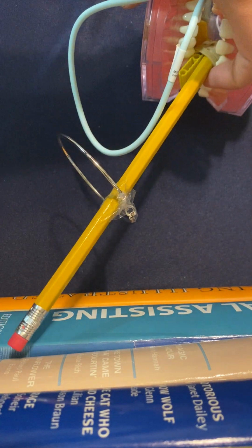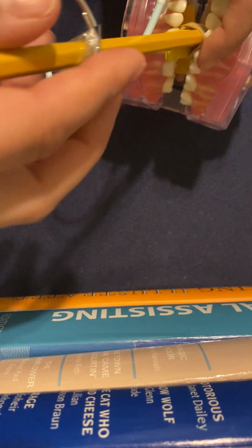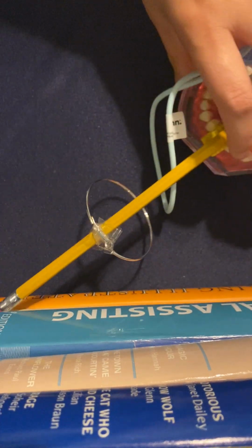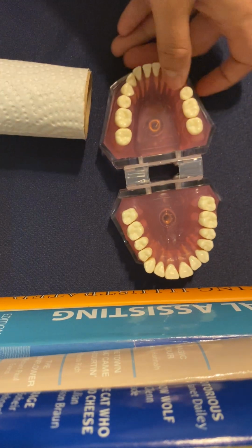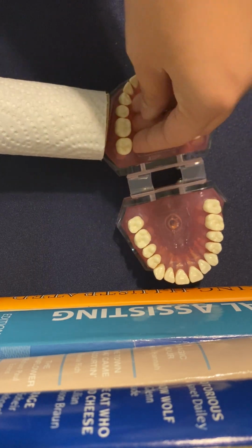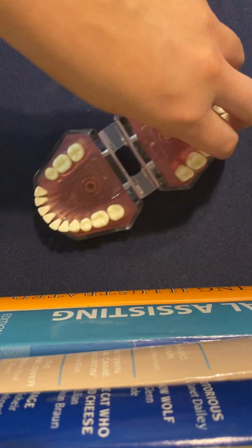And you're going to want to point down from the outer canthus to the mid-mandibular area. So let me see if I can get the PID going down like that. There you go. Line it up just like so. And when you do molar ones, you want to try and keep them very parallel with the teeth. With whichever tooth you're focusing on, you want to keep it parallel, because if you go like that or like this, it'll be a very bad cone cut. I've learned that from experience.